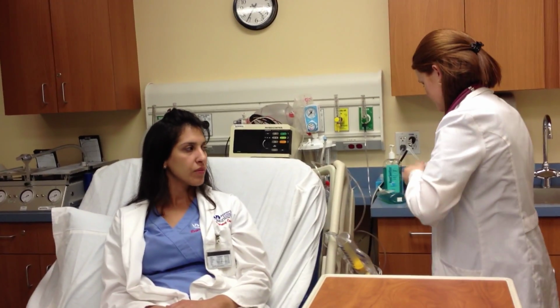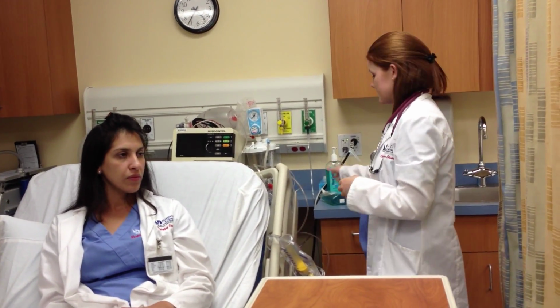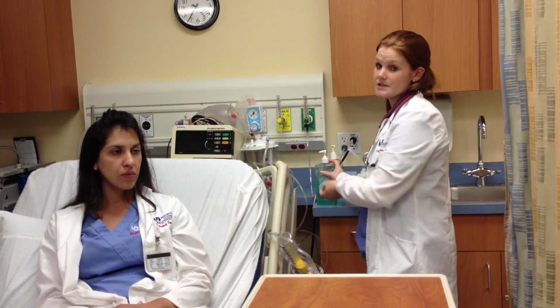Ask your patient if they are comfortable, if there's anything else you need. Are you comfortable? Is there anything else I can get for you? Remove your gloves. Wash your hands for 15 seconds, or use the hand sanitizer for 30.